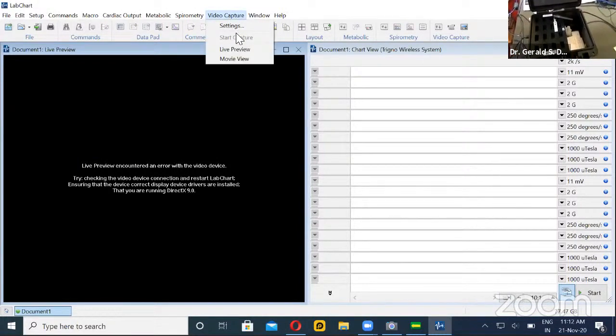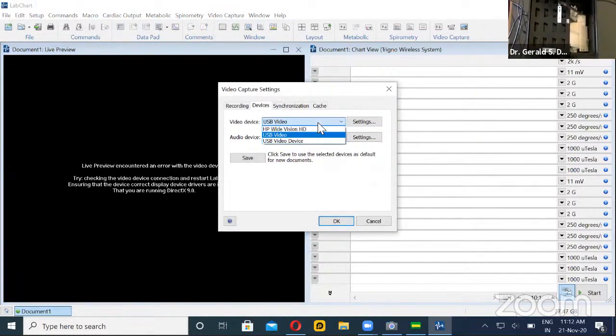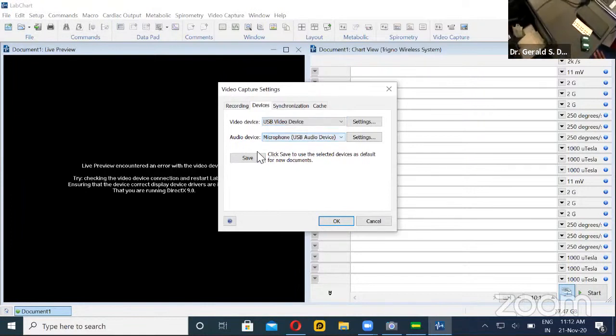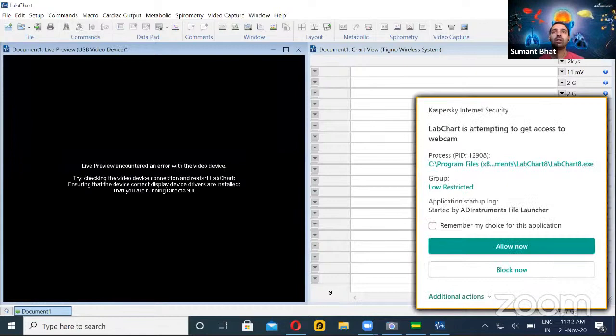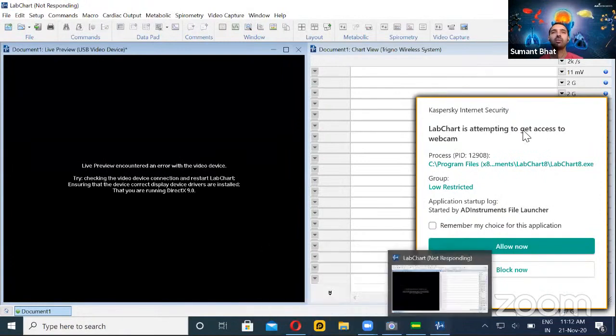You can see there is a video capture option. You can do real-time recording of the camera as well as the data acquisition, so that you can know at which part of the movement a particular signal occurred. I'll take this video capture and go to settings, and here I'll be doing USB video device because I have attached my digital camera.